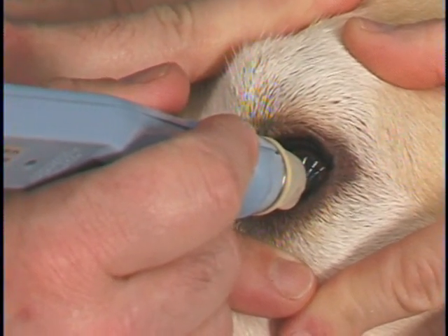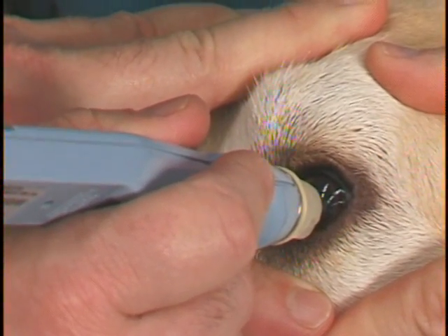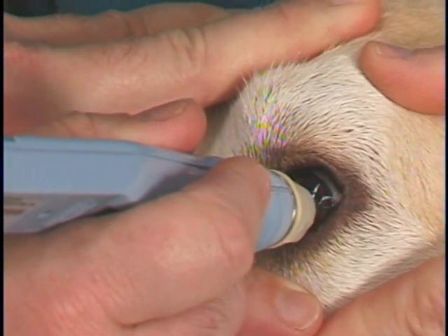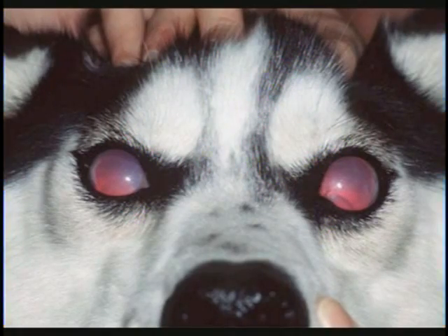In addition, the Tono-Pen will allow you to incorporate intraocular pressure determination as a routine part of the physical exam in those breeds predisposed to primary glaucoma. Since primary glaucoma is breed-related, routine determination of intraocular pressure can be part of a routine wellness examination in Cocker Spaniels, Poodles, Arctic breeds, Beagles, Basset Hounds, Bouviers, Dalmatians, Shar-Peis, Chow Chows, and other predisposed breeds.